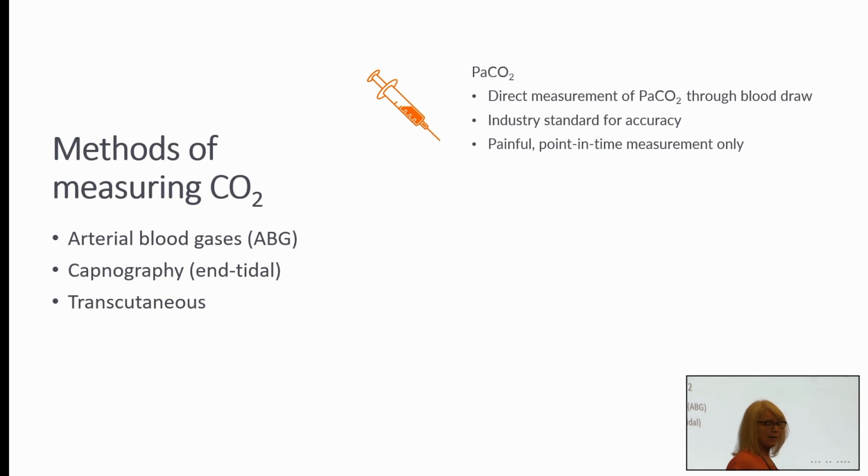We've also got end-tidal CO2 or capnography. That's going to measure the CO2 in a patient's exhaled breath. And that's nice because it's non-invasive and it's continuous, but its accuracy is going to depend on the quality of the airway, and it's going to be affected by any type of lung compromise. It's also going to be affected by what type of ventilation method you're using if you're using a respiratory assist device.